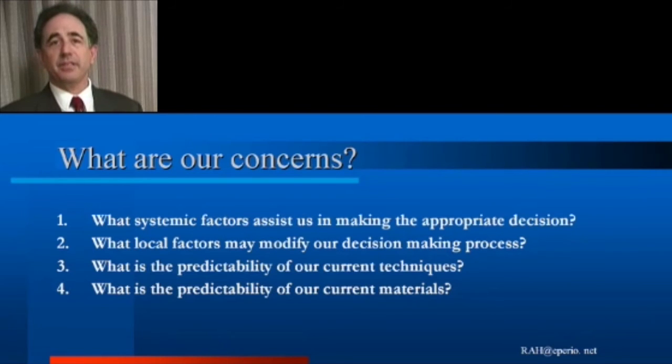The predictability of our current techniques, as you will see over the next series of lectures, depends on the graft and barrier materials that you as the surgeon choose to place at the time of extraction. Some of the materials that you've seen today in the initial lecture in our series are demineralized freeze-dried bone with calcium sulfate and tricalcium phosphate. Some of them are fully resorbable and replaced by bone in the 4 to 6 month period in which we would like to place our dental implants.